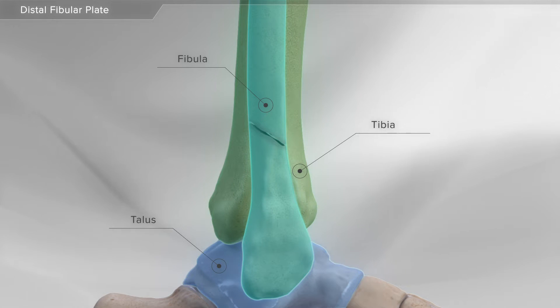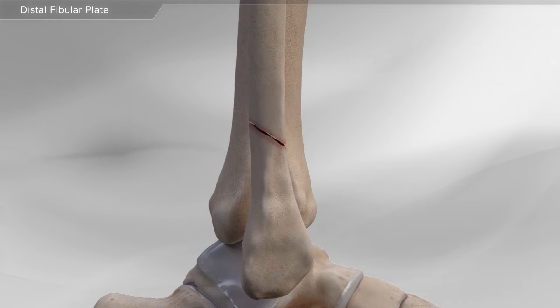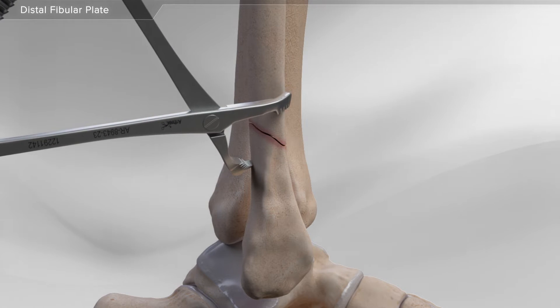The most common ankle fracture usually involves the fibula. First, your surgeon will make an incision over the fracture, and a clamp is used to hold the broken bone in place.